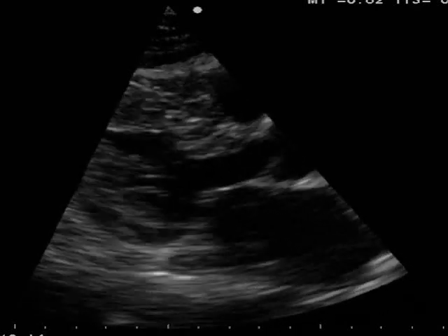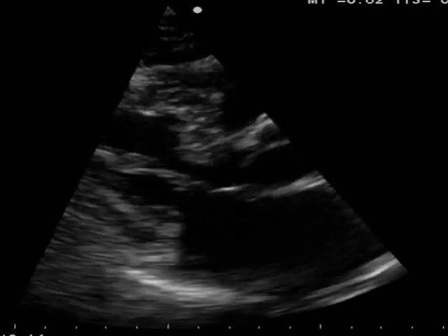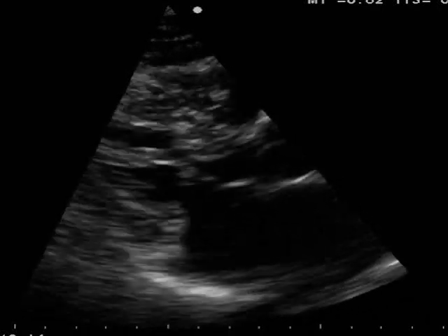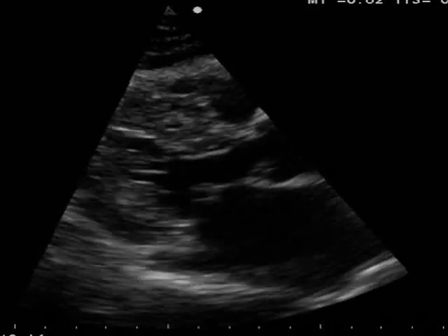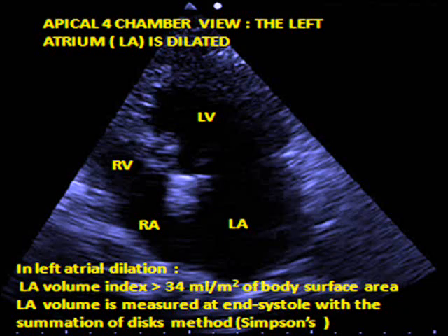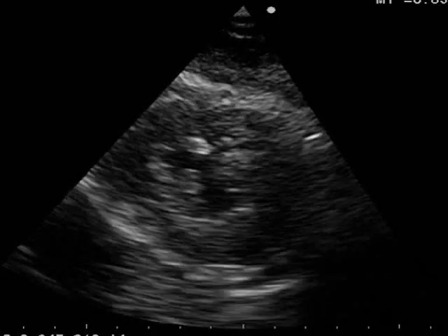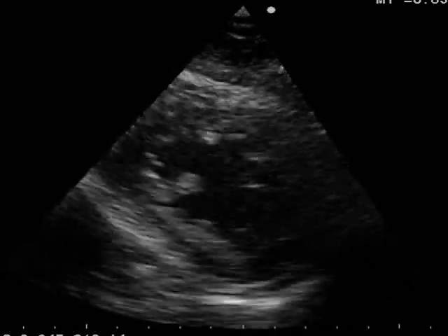The left atrium is also mildly dilated. Left atrial enlargement is a finding often observed in hypertensive heart disease and is due to diastolic dysfunction. The left atrium is enlarged if its anteroposterior diameter is over 4 cm, or if its volume measured from the apical four-chamber view is over 34 ml per square meter of body surface area. The short axis left parasternal view at the mid-ventricular level also shows left ventricular hypertrophy and good contractile function.